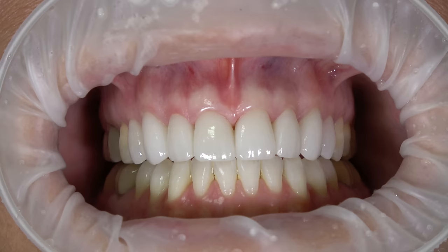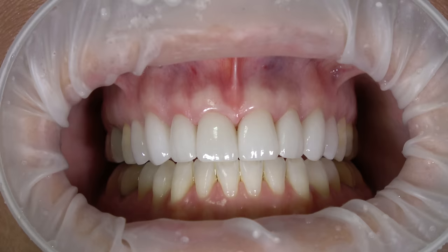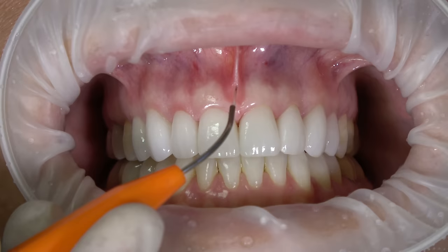The diode laser is attracted to dark pigmentation like melanin. So a patient that has a lot of melanin — Black American, Mediterranean — we typically would use lower wattage or lower energy than someone that is light-skinned or most Caucasians.